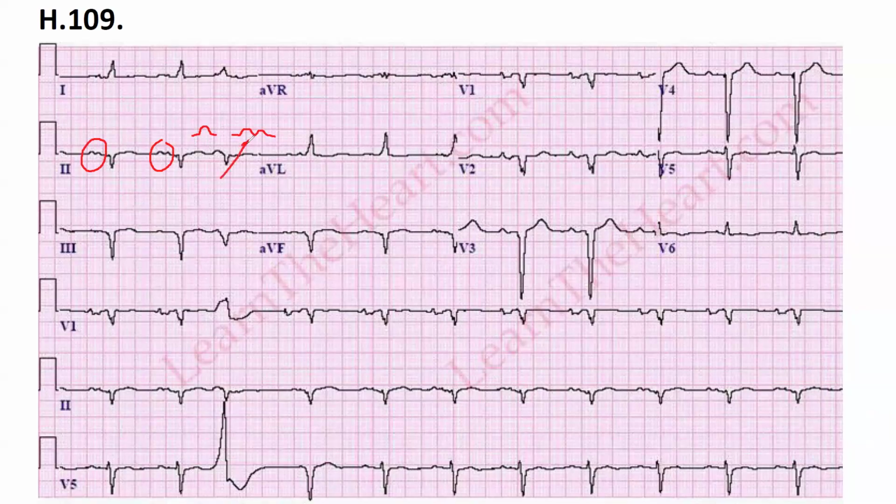What can it be? Something that's abnormal with the atria. What is abnormal in the atrium? Maybe the conduction from the SA node to the AV node. Well, an intraatrial conduction problem, or the P wave is wide, but we haven't discussed the intraatrial conduction abnormality yet, because we do have some preferential pathways.